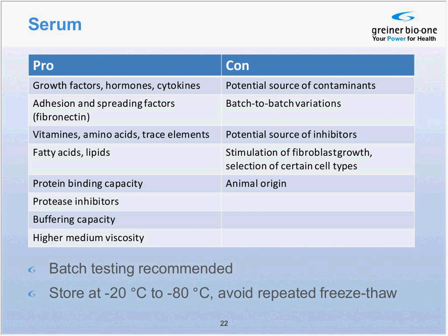For certain immunological questions, cytotoxicity assays or virus screening, complement inactivation might be useful, but for the majority of applications, the detrimental effects of heat inactivation towards the actual beneficial components in serum make heat inactivation most likely undesirable.